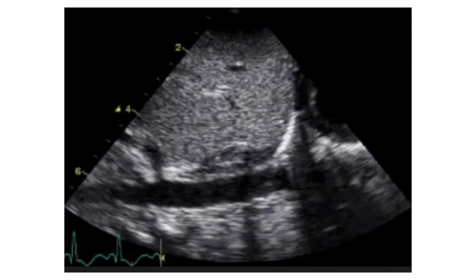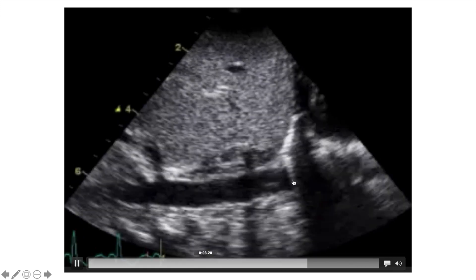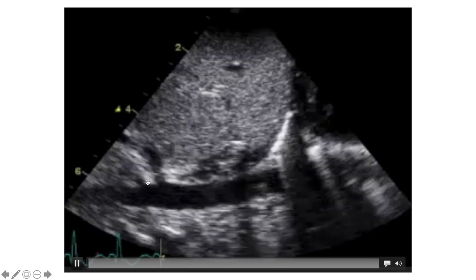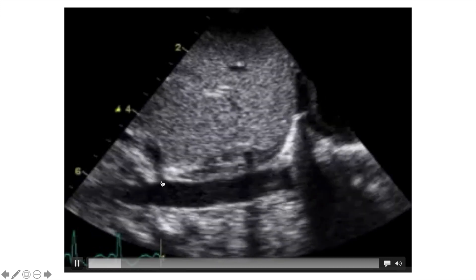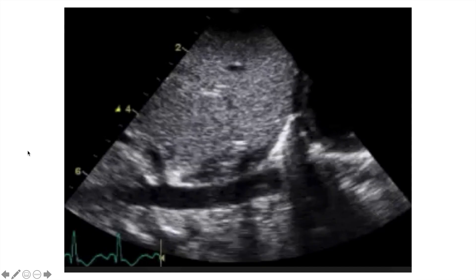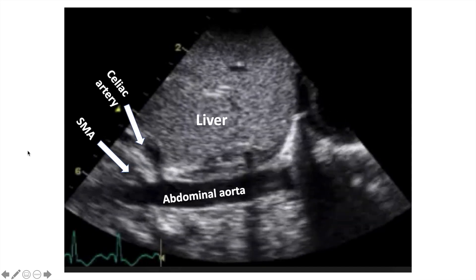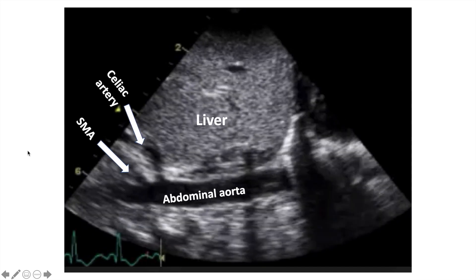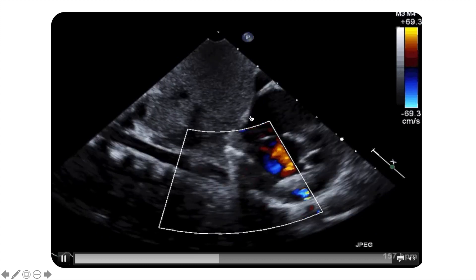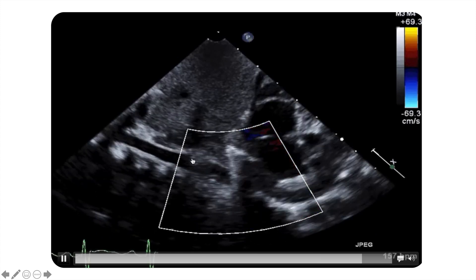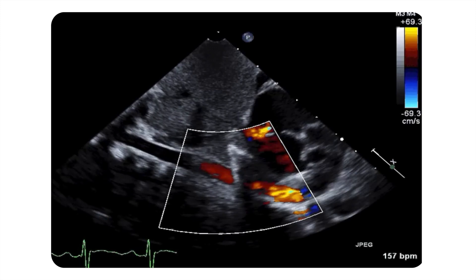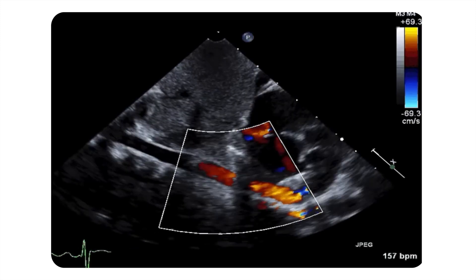This view shows the abdominal aorta, the celiac artery, and the SMA with labels. We can apply color Doppler to see the blood flow in the abdominal aorta and obtain a Doppler flow pattern.